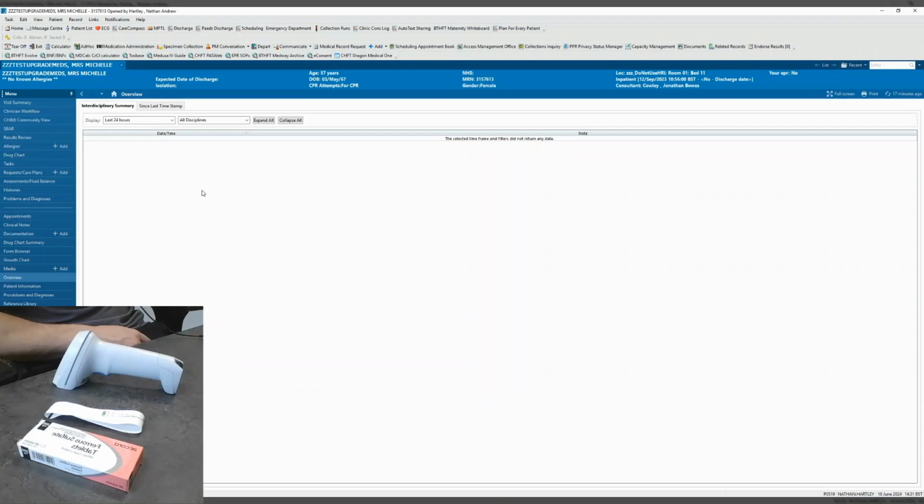In this first tutorial, I'm going to show you how to administer medication correctly with no issues identified during CLMA. This involves the right medication, right dose, right route, right time scanned, and the example I am using is ferrous sulfate.